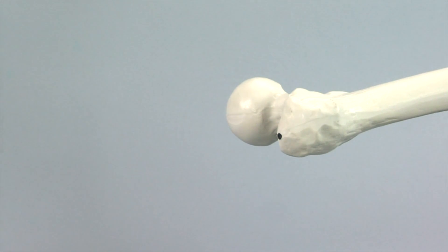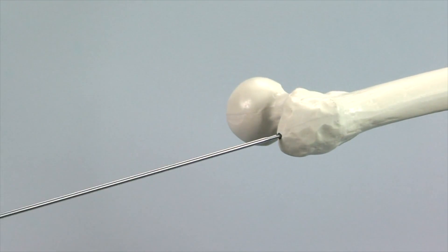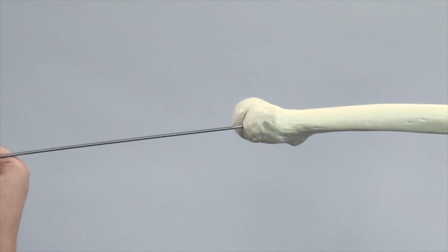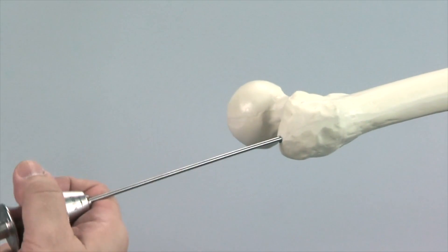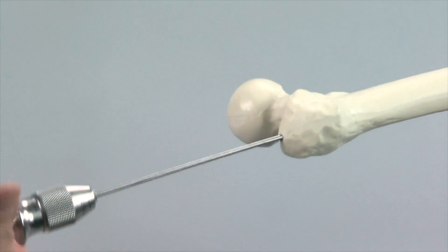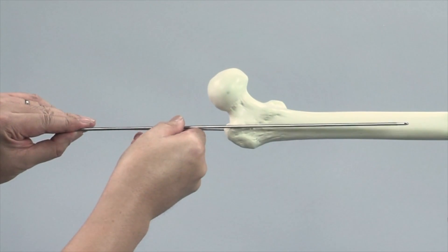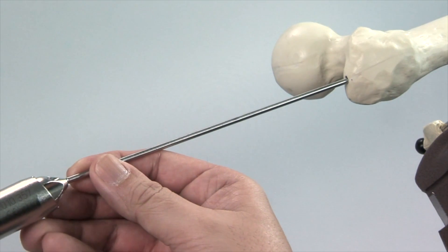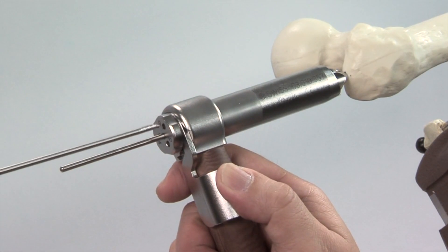The 3.2mm guide wire mounted in the universal chuck with T-handle is inserted into the tip of the greater trochanter. In the lateral view, the guide wire must be on the longitudinal axis of the femur and centred in the medullary cavity. Any other position will place the guide wire either too dorsally or too ventrally, which would hinder smooth introduction of the nail. In younger patients with strong bone, or with the bone model for this exercise, it might be necessary to use a power tool to insert the guide wire. To check the insertion depth, a second guide wire can be laid alongside the first. If the position is incorrect, the multi-hole drill sleeve can be used to insert a second guide wire parallel to the first in a better position.